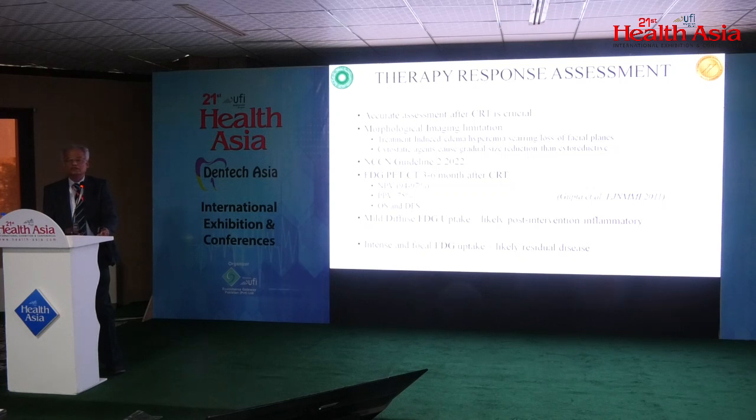As a general consensus among the nuclear medicine fraternity, if there is mild diffuse FDG uptake, we usually call it post-intervention inflammatory changes, but if it is an intense focal FDG uptake, we call it residual disease.